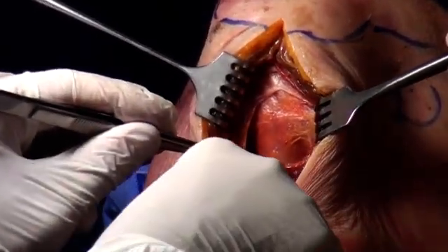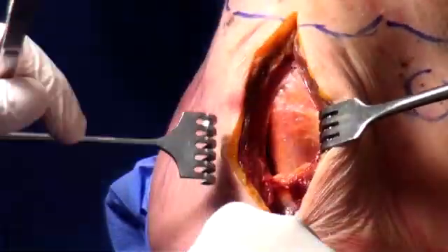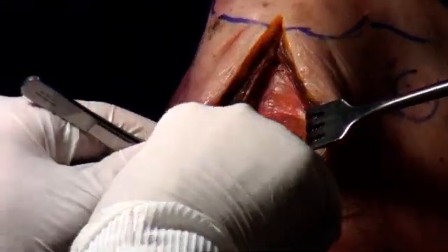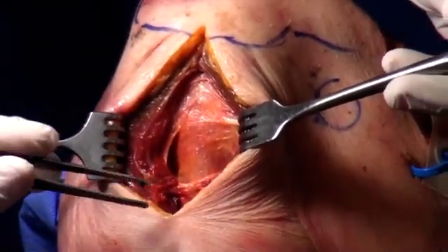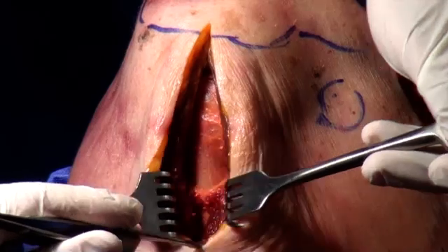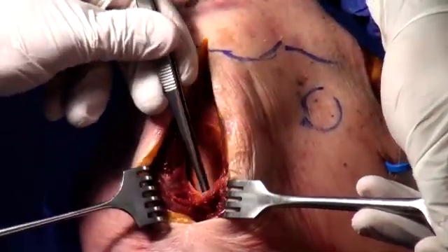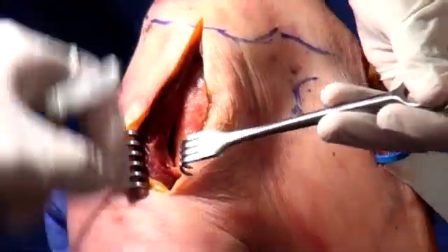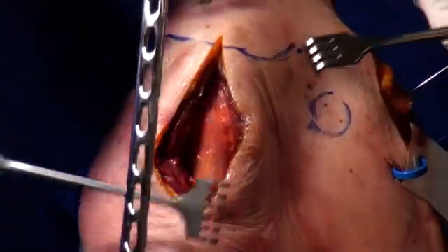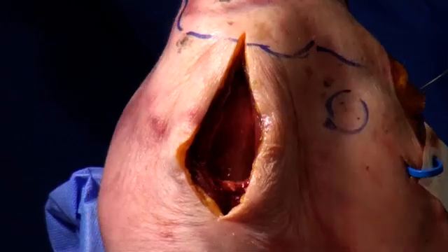I can feel it now. With just a little bit of dissection, you can see it going horizontally. Now we've created the space. To insert the plate, we have to relax the nerve a little bit. But we're not going to do this until we expose distally first. That's the proximal section done — the distal incision is next.